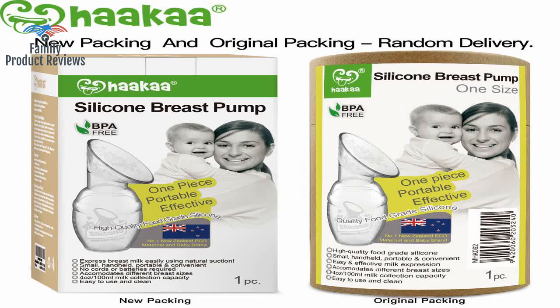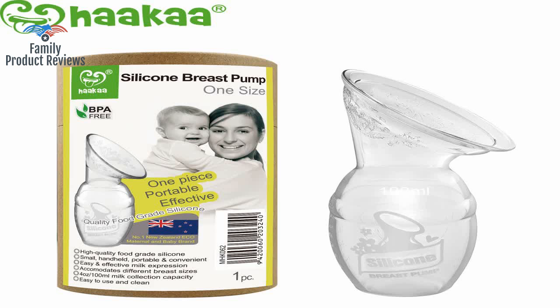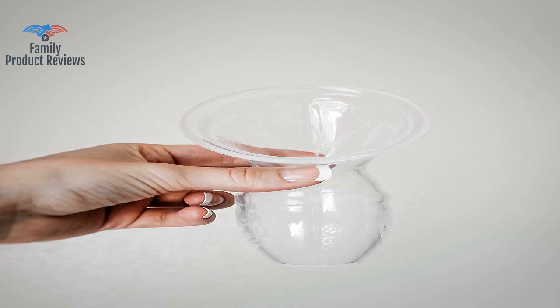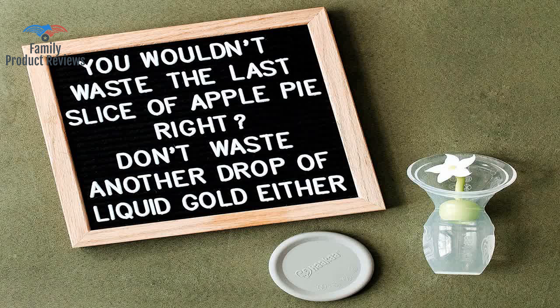Don't worry if you don't overflow — being able to save a little here and there is worth it, they add up. You don't have to worry about all of the tubes and pieces that come with electric pumps. All you have to do is suction the pump onto your opposite breast while breastfeeding and it collects any leakage of milk.